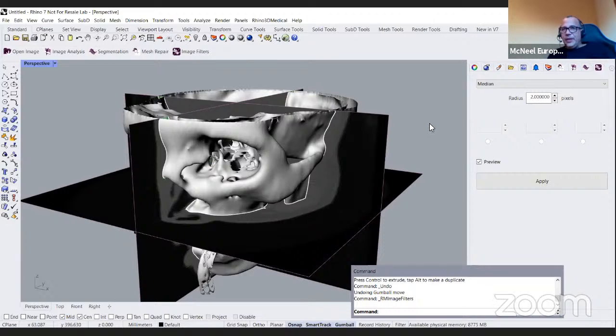What else? Servicio Radiodiagnóstico CHT asks, what kind of material are you using to print these guides? I guess it needs to be approved by the medical authority. Yeah. So we print anatomical prints with different kinds of resin, and for the surgical guides we have not printed yet. That was up to Dr. Julio, and I guess also some kind of resin. Yeah, it has to be approved.